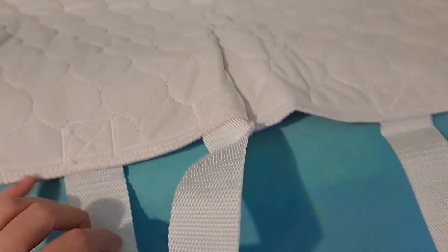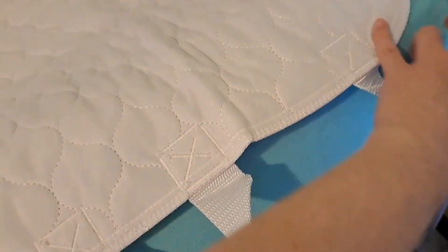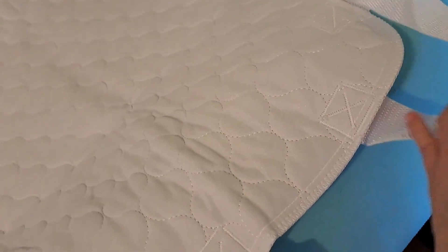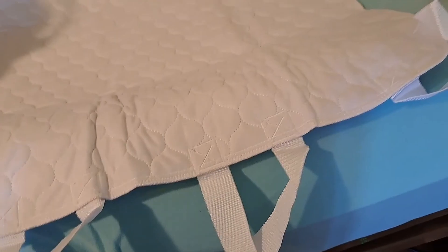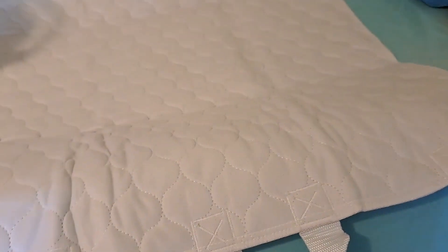The straps are not completely even on this. One is at the very head of it, and then middle — there are no straps at the foot of it. I tend to think that this one goes up by the head.